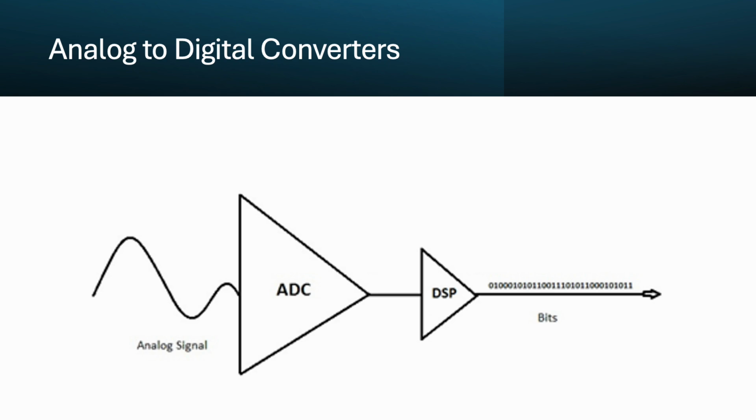This is known as the Nyquist theorem. If the criteria is not followed, then the incoming signal that are above f over 2 will be aliased or replaced with frequencies that are different from the original signal when the waveform is reconstructed or viewed. Aliasing means the frequencies are recurring at a rate that's not displayed reliably.